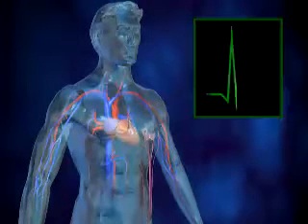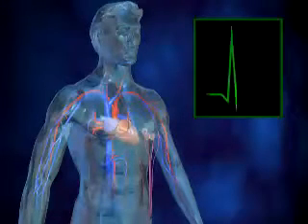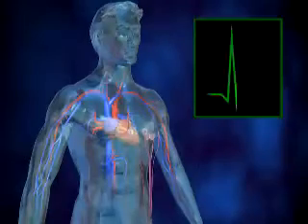During this test, electrodes are placed on the chest and recordings are then made of the heart's electrical signals. Sometimes the electrodes are also placed on the arms and legs.